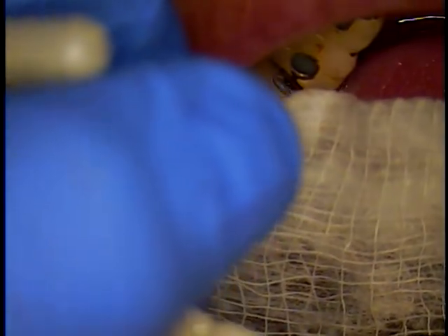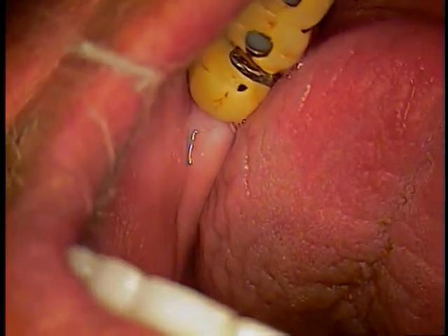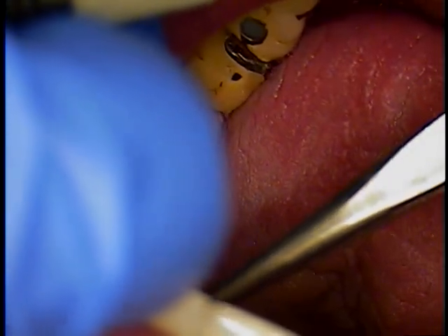Give me a throat pack, please. Throat pack. 2x2 gauze. This one's okay. Two hands, please.